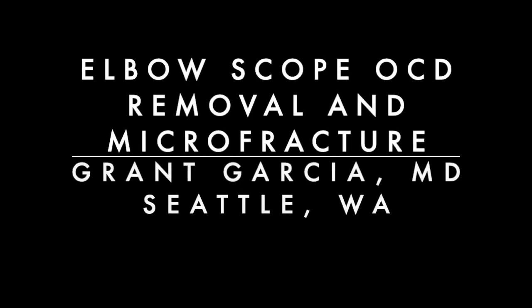Today we're going to demonstrate our technique for elbow arthroscopy, removal of OCD of the capitellum and microfracture of the base.